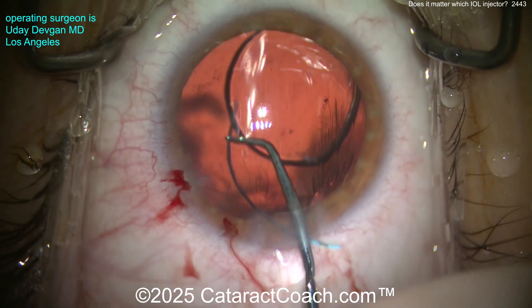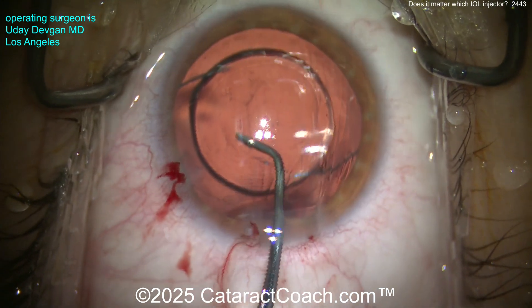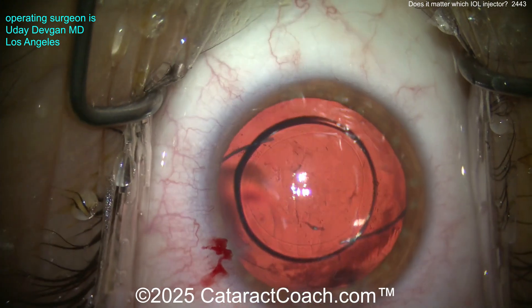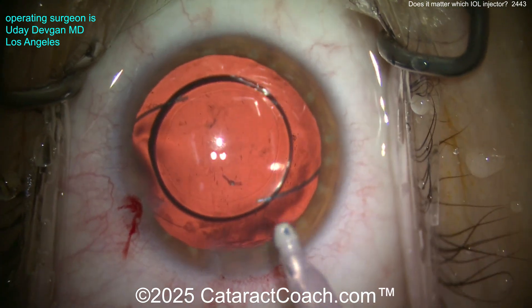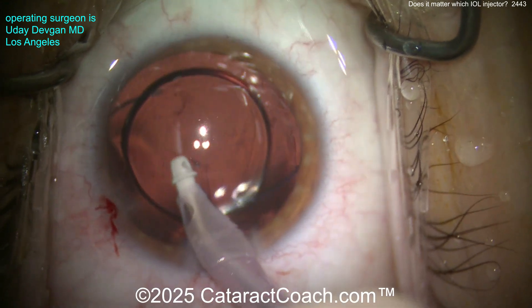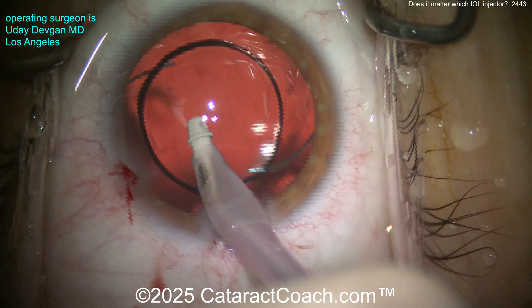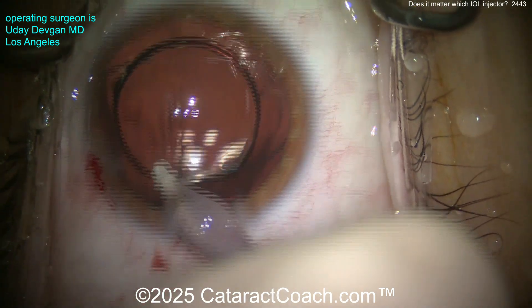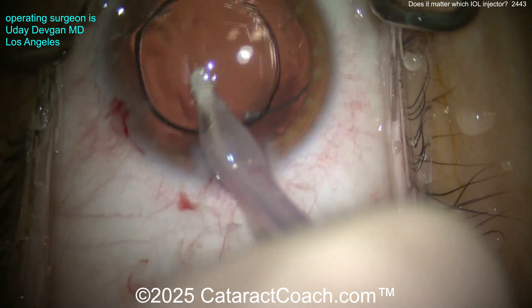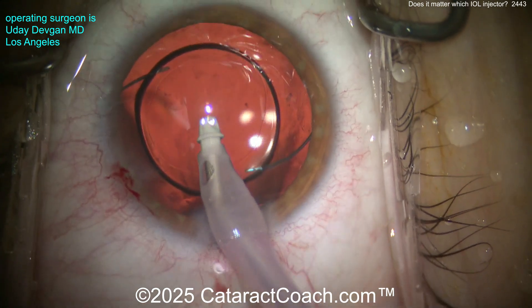Look how thick the lens is. Why is it so thick if the eye power is only 4 diopters — shouldn't it be thinner? It actually looks thicker than a 20-diopter lens. Remember: meniscus design. This is not a typical biconvex lens — this is a meniscus design lens. If you don't know what that is, go to cataractcoach.com and type 'meniscus' in the search engine. I promise you'll learn and be thankful you did.